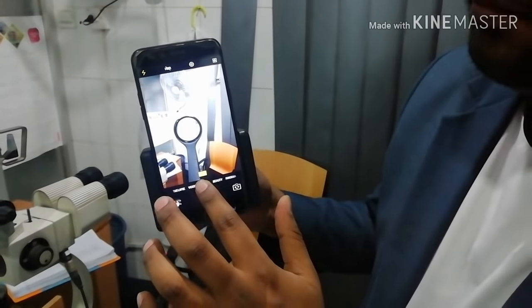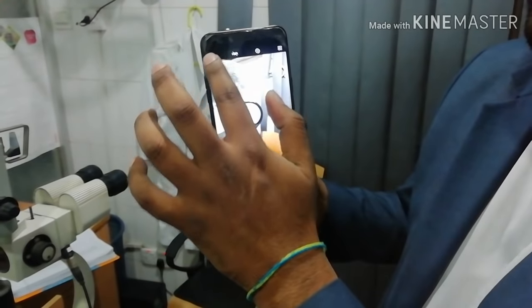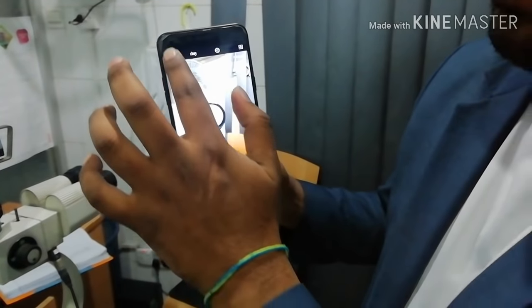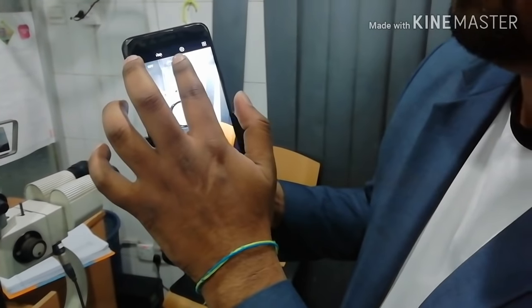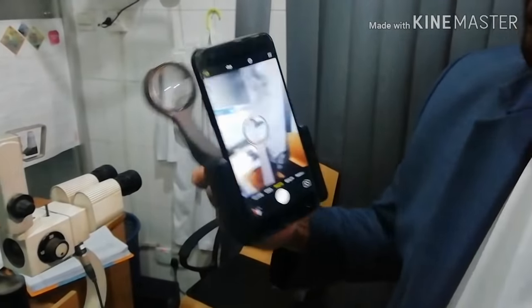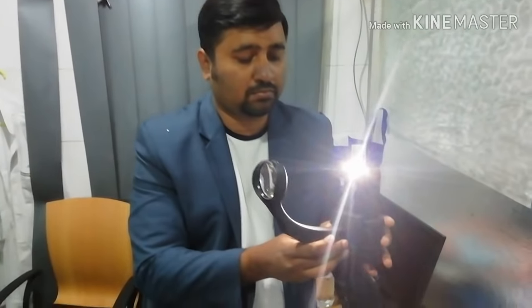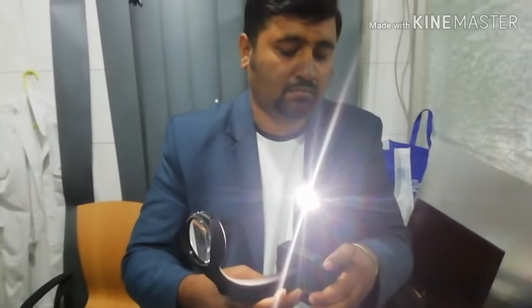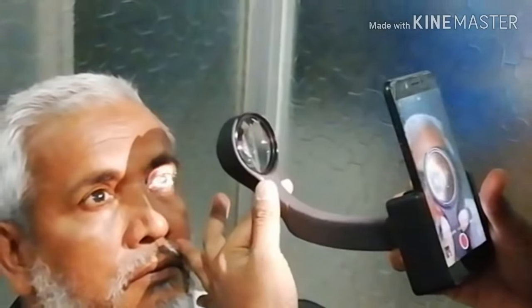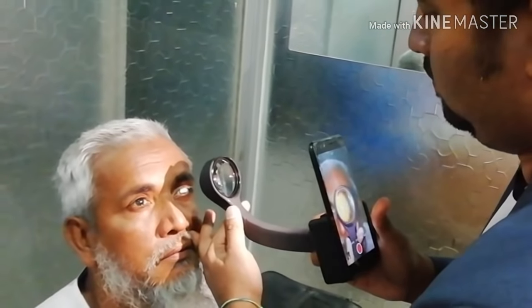After fixing the mobile phone and 20D adapter lens, just turn on your mobile phone camera. Then you have to set your mobile phone flashlight to continuous mode. You can see the mobile phone camera flashlight is continuously on. You have to hold the device 5 centimeters away from the eyeball.